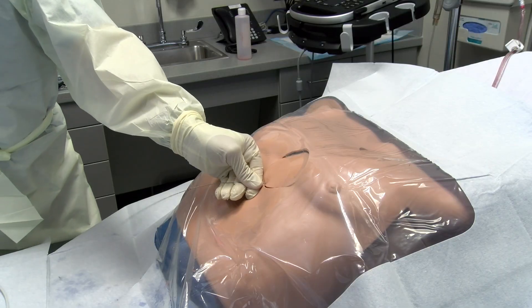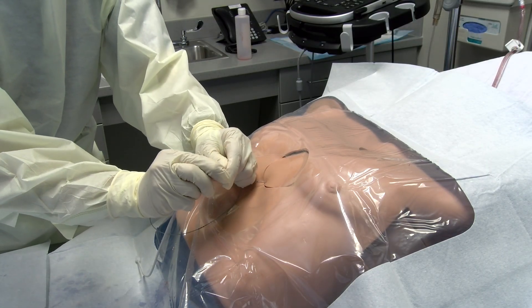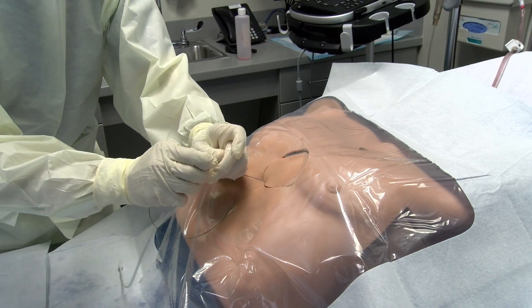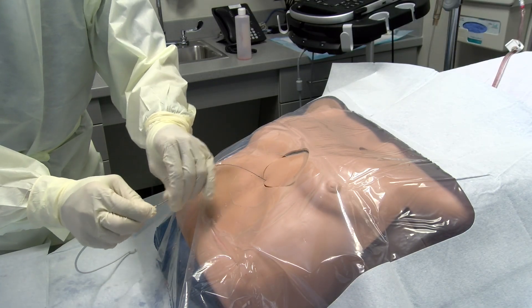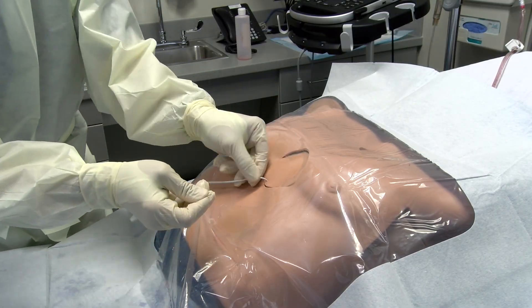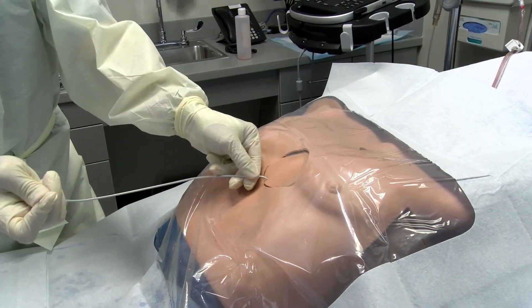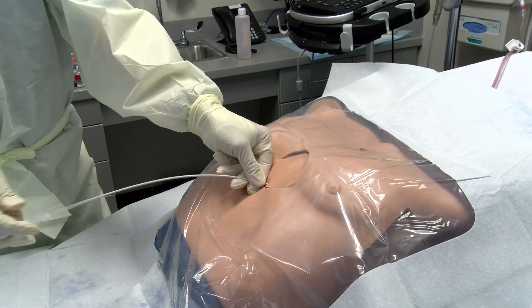A dilator can now be passed and removed prior to threading the pigtail catheter over the wire. Once the catheter is in place, the guide wire may be removed and a three-way stopcock can be attached.